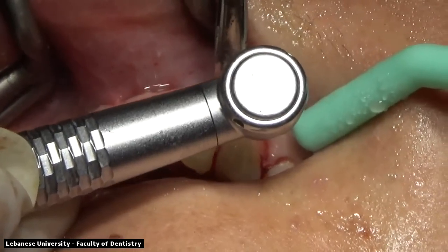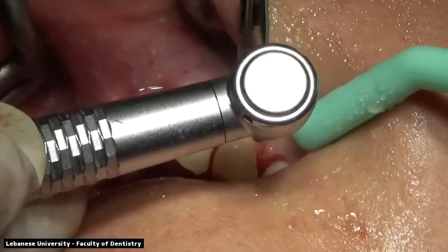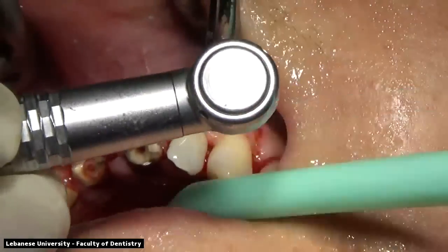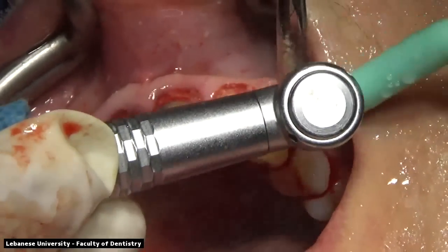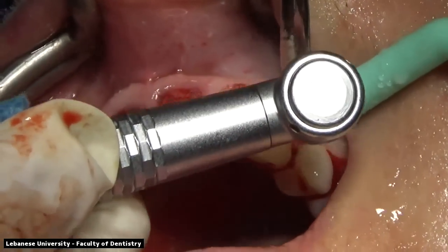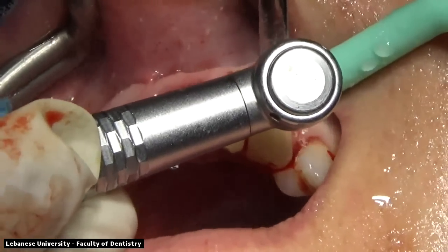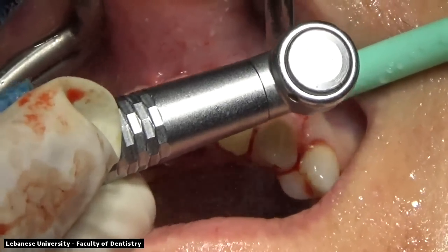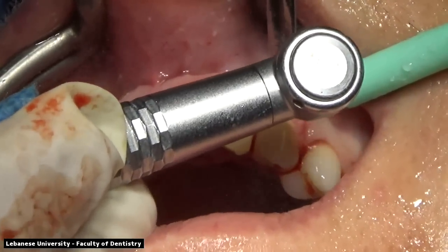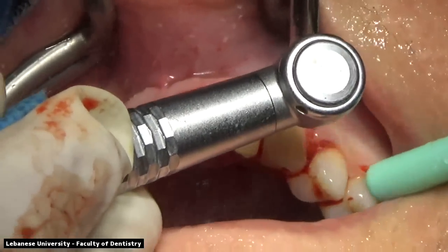The bone removal is done in a scalloped way, which is uniform from the mesial side to the distal side, without creating any bony dehiscences or fenestrations. We make sure it's done in a slow manner, and that the touch is not too deep and not too aggressive, so that we can keep the bone attached to the root surfaces. Very gentle pressure with the round burr.